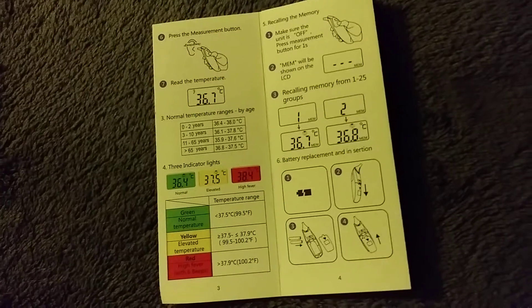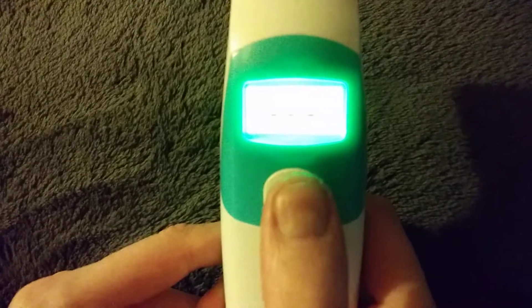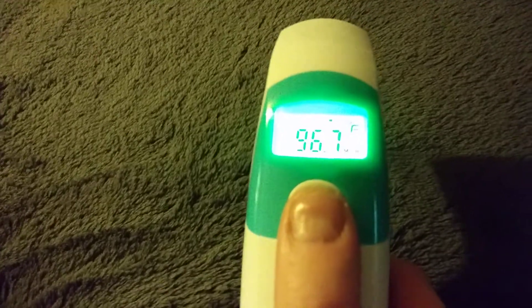There's also a recall function on the thermometer. While it's off, you just hold down this button, and it'll light up in green. Then you click through each reading — that's your last one, the one before that, and so on.